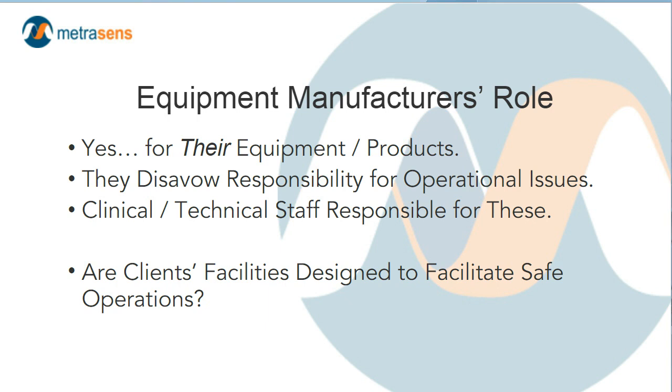For example, there are all kinds of disclaimers in the contract language and the operator's manual essentially saying that the equipment manufacturer is not responsible for any decisions, point of care related decisions that might produce an accident or harm. If their device malfunctions, yes, that's on them.